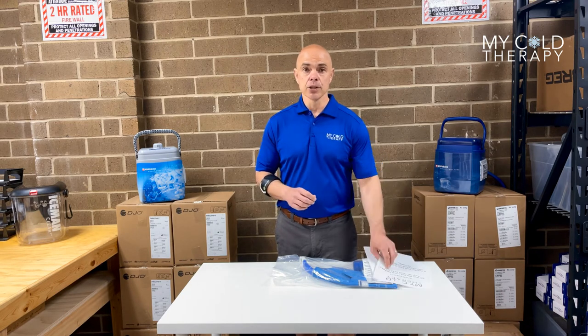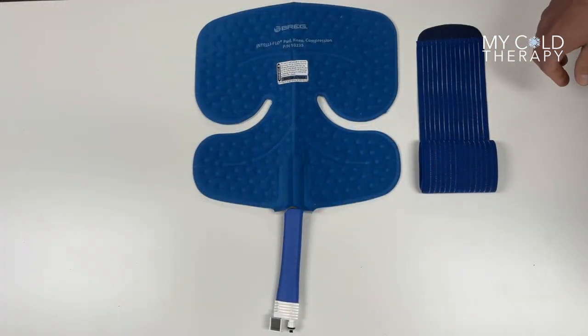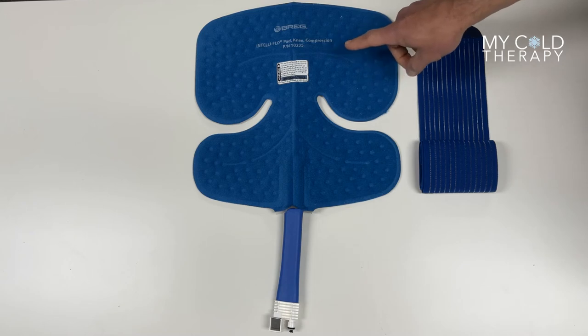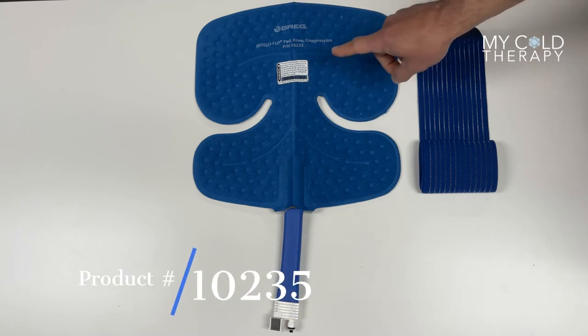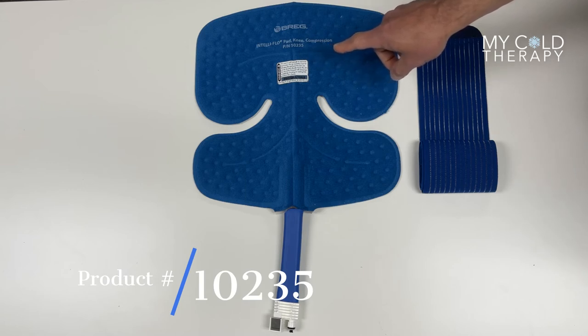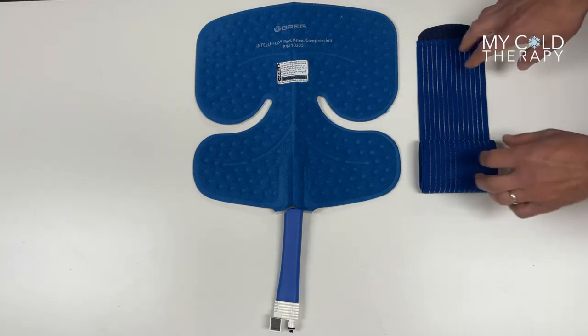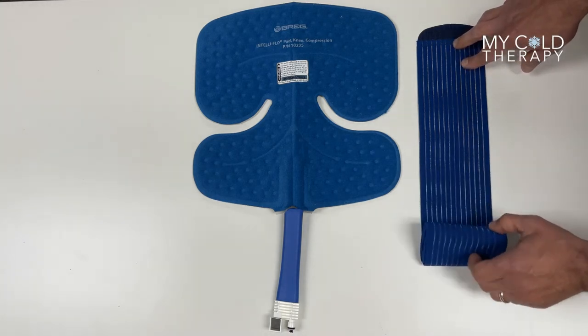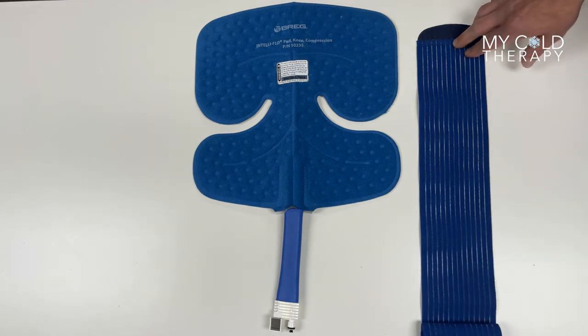Now we're going to talk about the dimensions of the pad. Every Bragg pad comes with a part number written on the front. This is the Intelflow pad for the knee with compression straps, part number 10235. This particular pad comes with one strap which is 60 inches long. The reason why it's 60 inches long is because you just keep wrapping the strap around your knee to provide a little bit of compression.